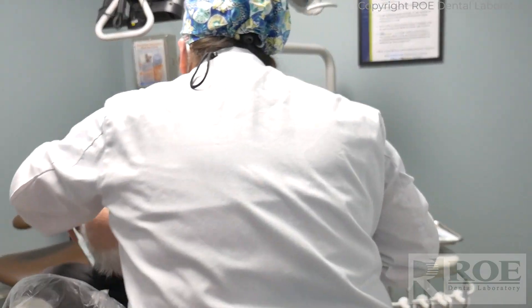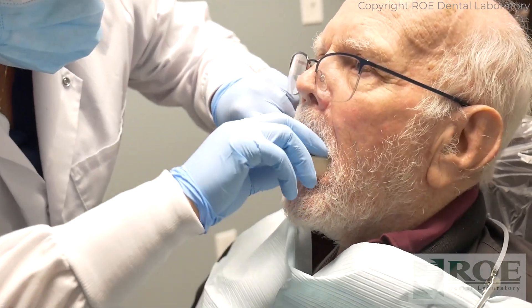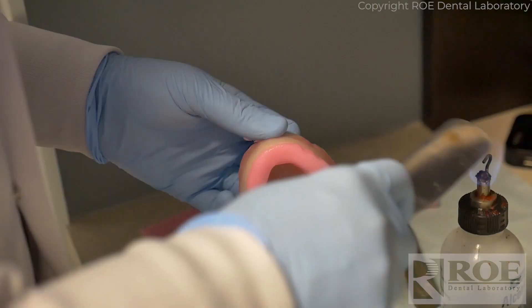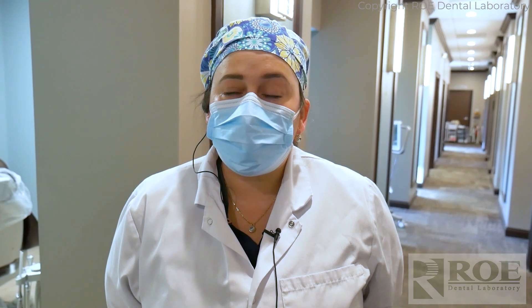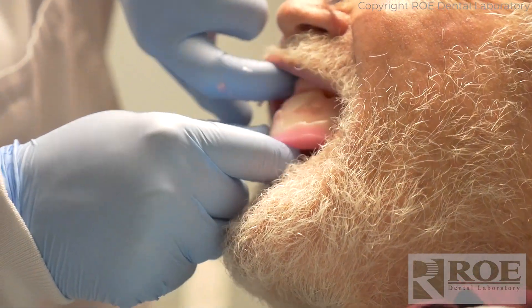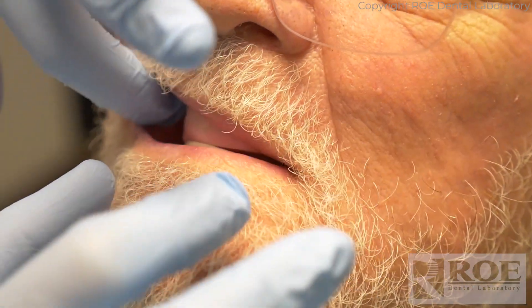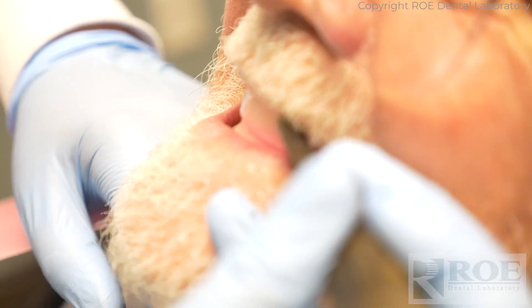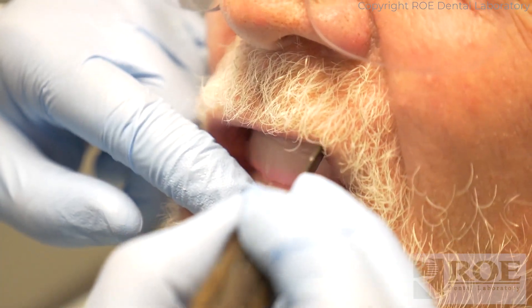When I was a resident, I had the opportunity to look into the digital denture world because the lab was training for it, but I never got to finish a case. So this is the very first time the opportunity came to do a digital denture. I'm super pumped and excited — I can't wait to see the try-in and the digital piece of the actual denture.